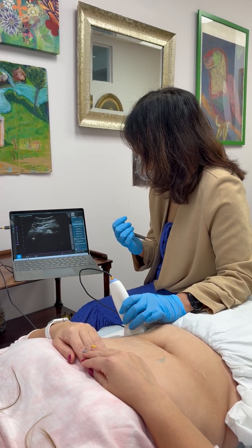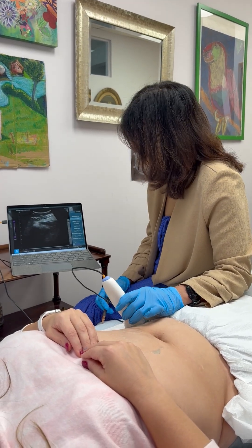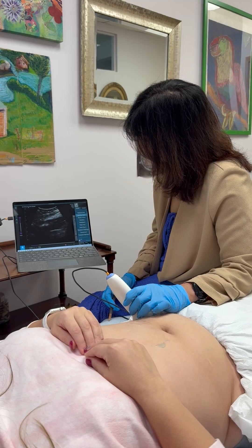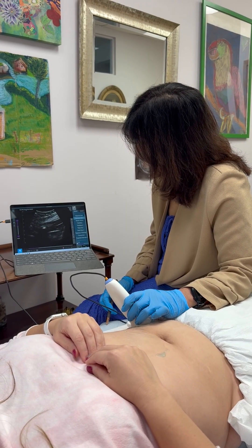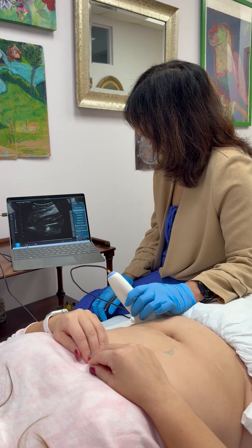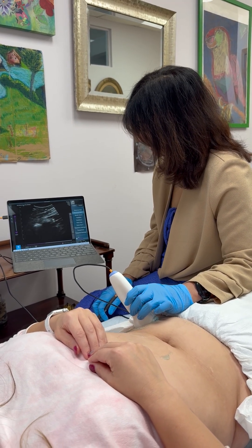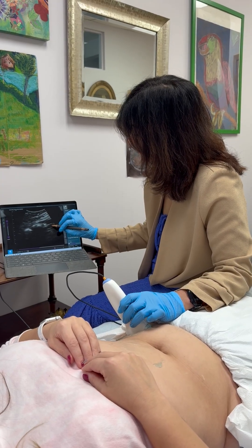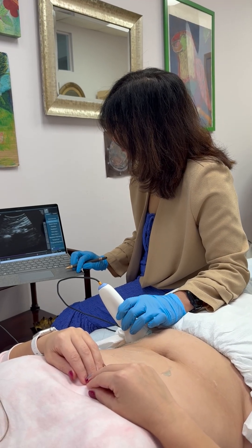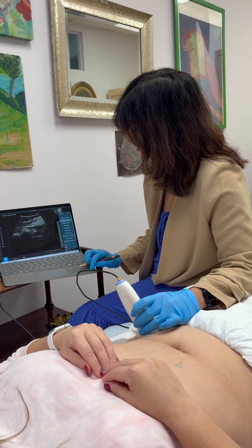Good, and look up. Take a big breath — breathe out. Another big breath — breathe out. Good. Now when you breathe out, do a little Kegel squeeze of your pelvic floor with the out breath. Good. So we saw a little core activation there. Now do that fogging the glasses again, and again — and now do your core. Let go. I like that we are seeing the core activating; that's already a good sign.